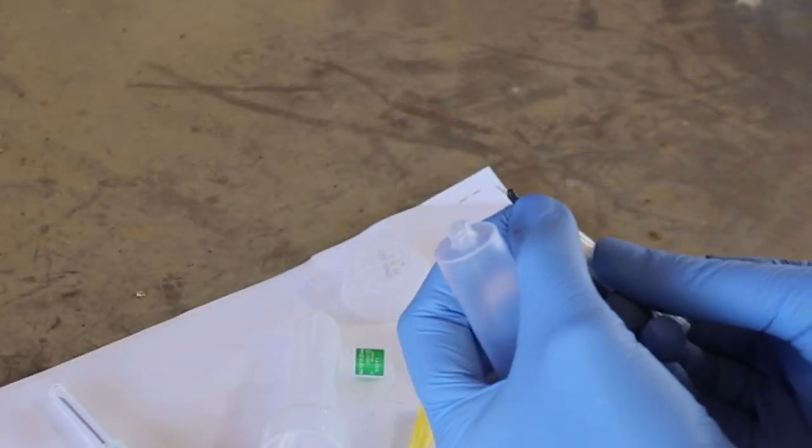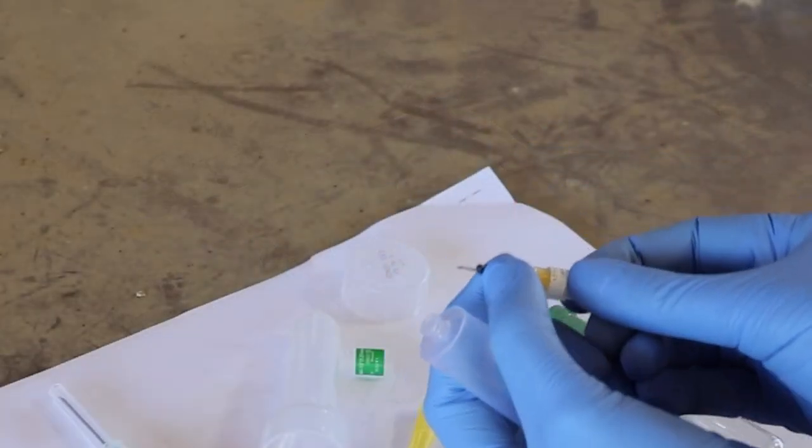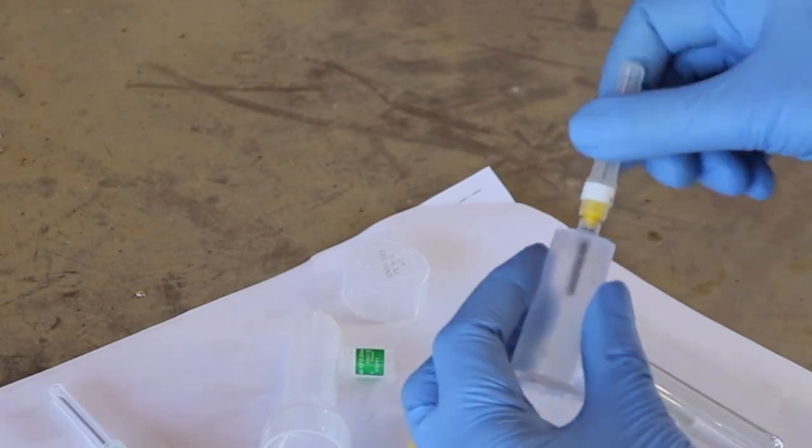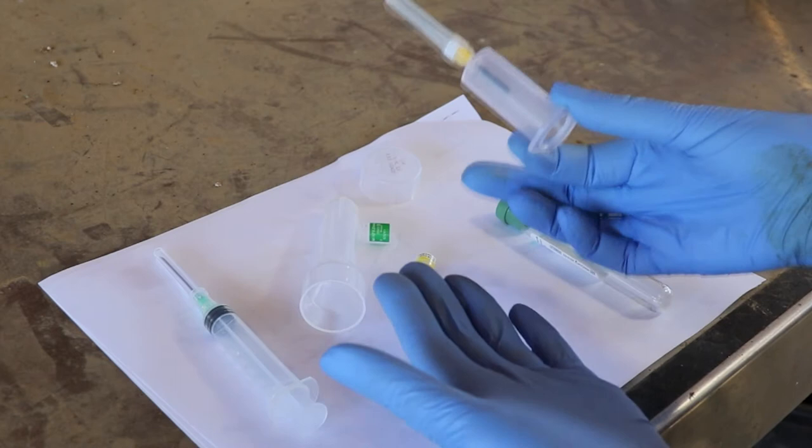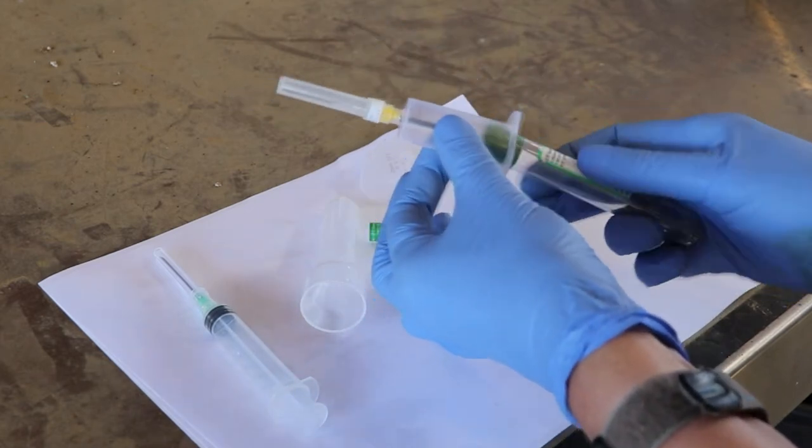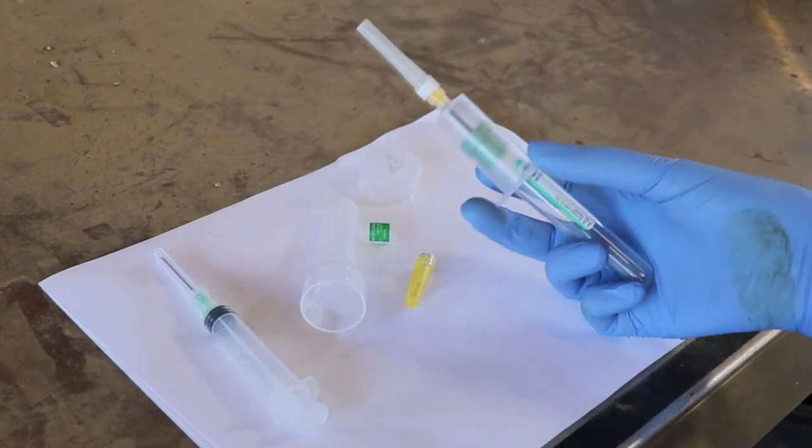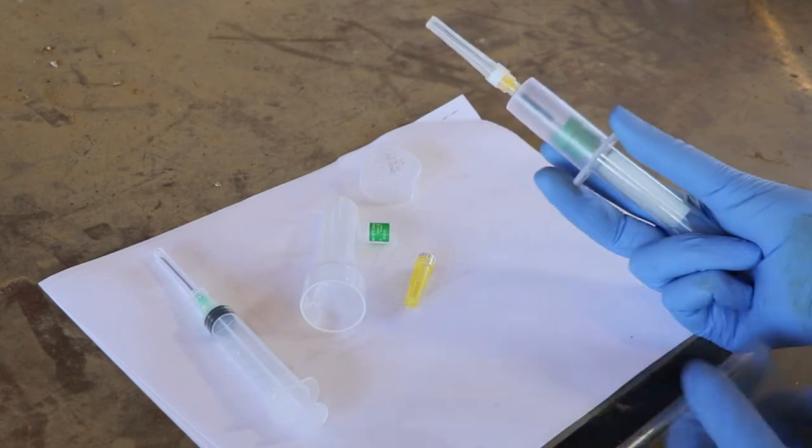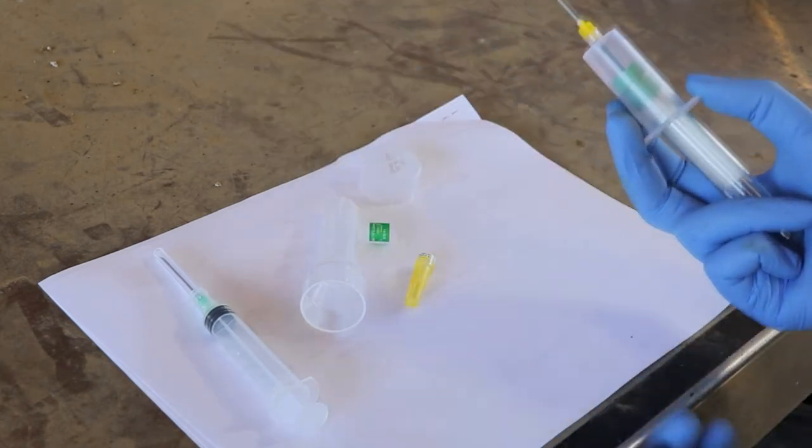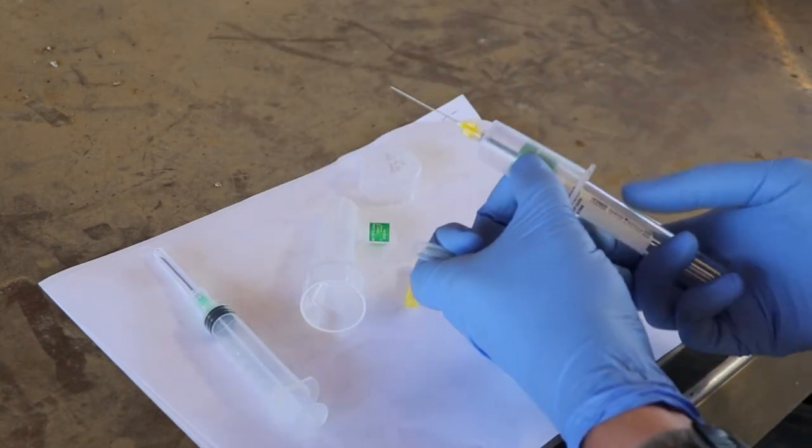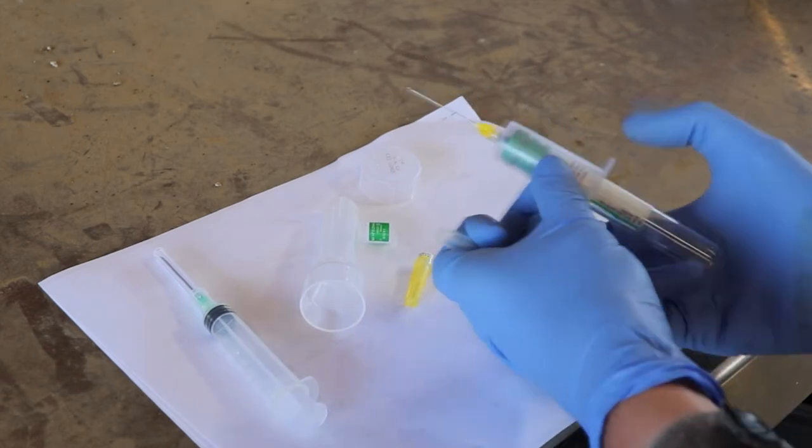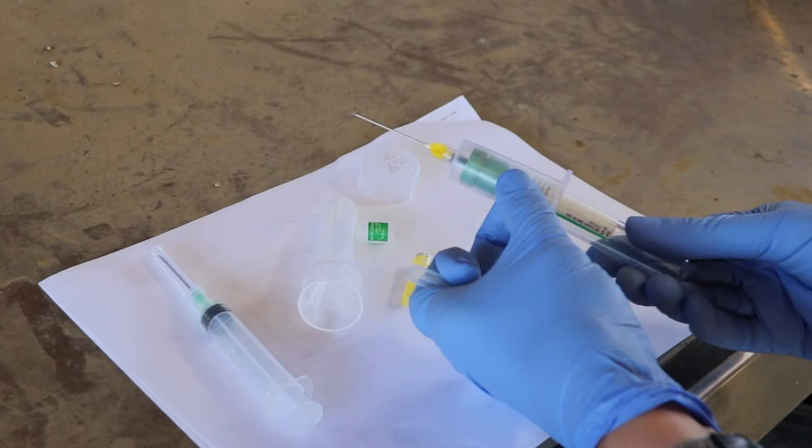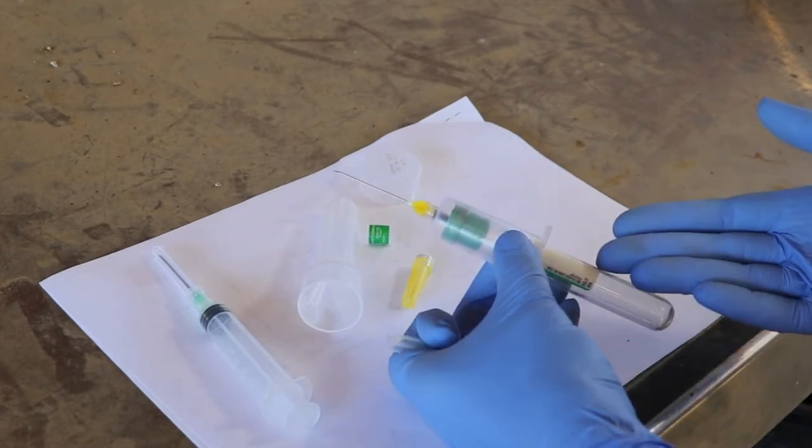Or you can use this type of needle with a hub. They come with or without this little rubber piece that protects the needle and stops the blood flow when you detach the blood tube, so it helps keep things clean. This setup requires a little more dexterity because you have to hold the blood tube in place but uses fewer materials. Also, once you attach the blood tube to the needle and you are not in the animal, the tube will lose its vacuum and will no longer be usable.